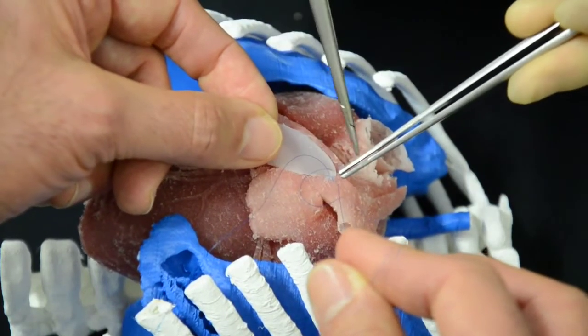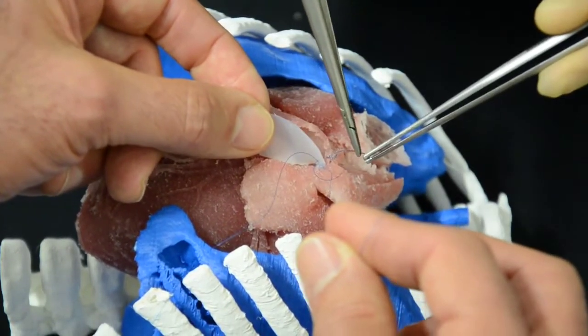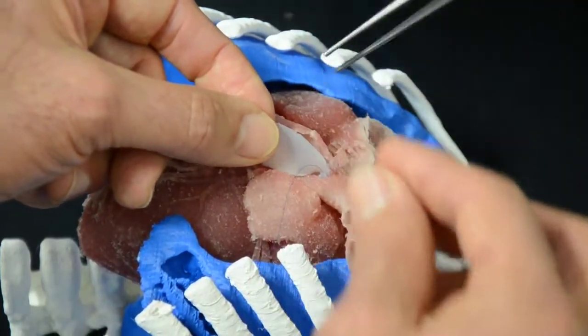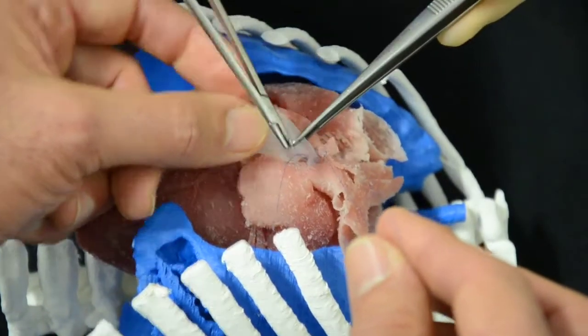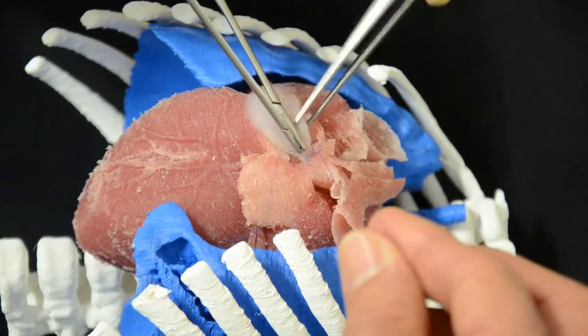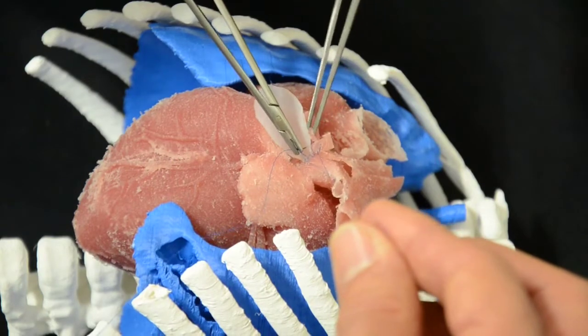It's very soft material, the silicone — the patch and the heart. It's quite similar, it's a good feeling. You can even tear it easily, so it's good to train how not to tear the tissue.